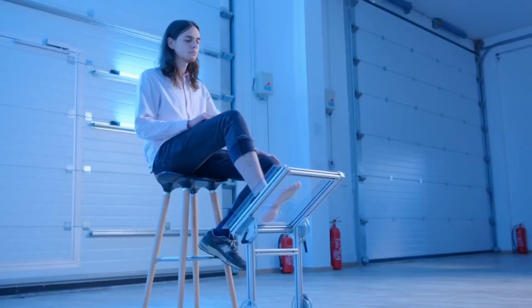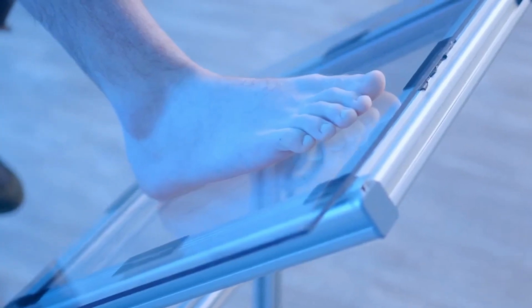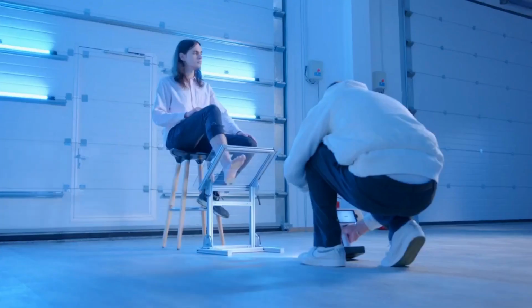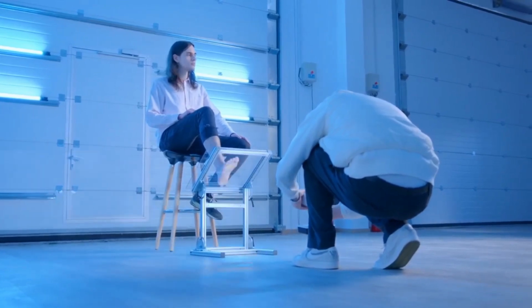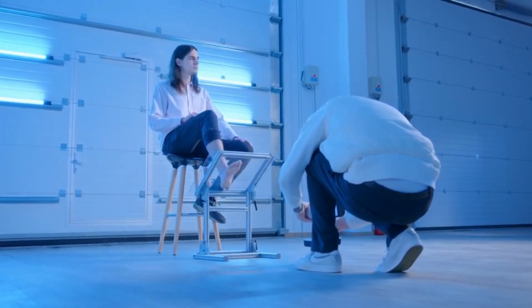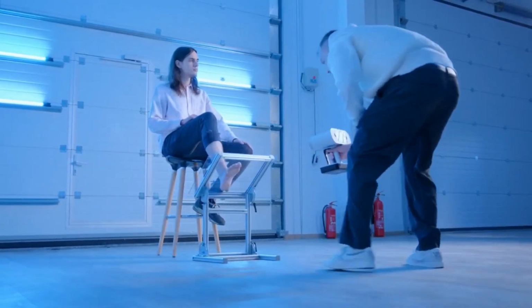All right, for foot scans, that's something that we're going to discuss next. So for foot scans, depending on the requirements, the scan can be made under the full load, meaning the body weight, partially loaded, or neutrally unloaded. To obtain a precise scan of the arch of the foot, we asked our model to press their foot against our glass table. As you can see, the size of the table is perfect because it allows us to maneuver around it, and the height can be adjusted. So we can scan from the bottom as well.